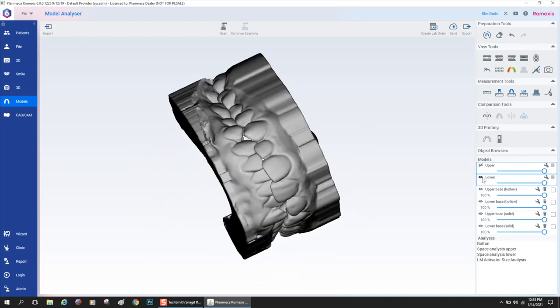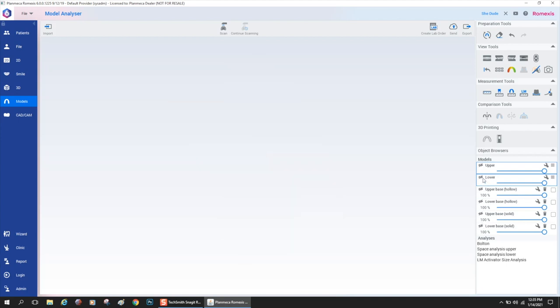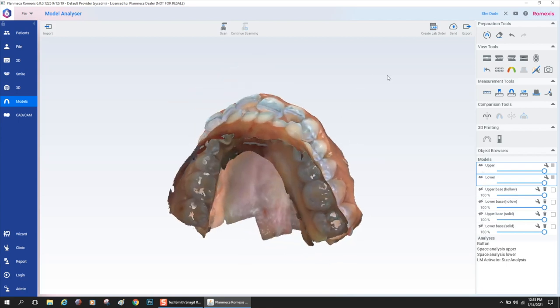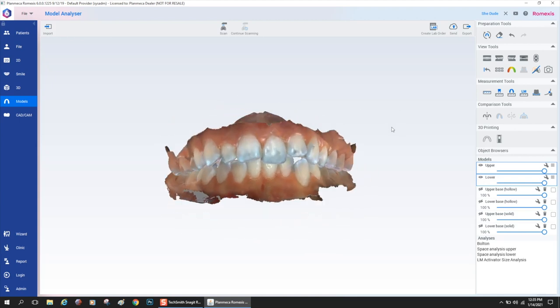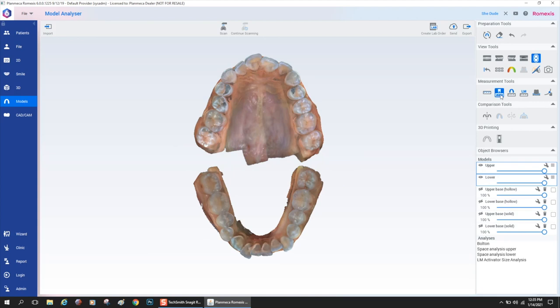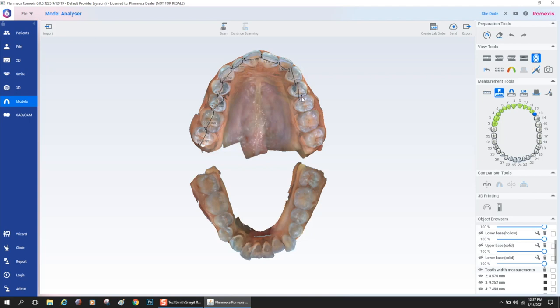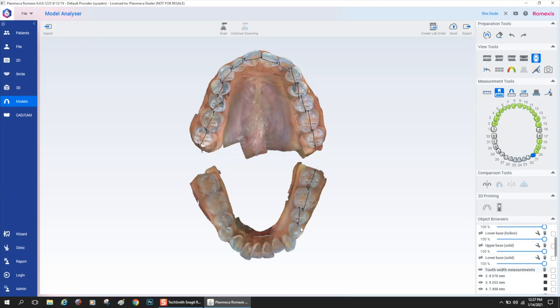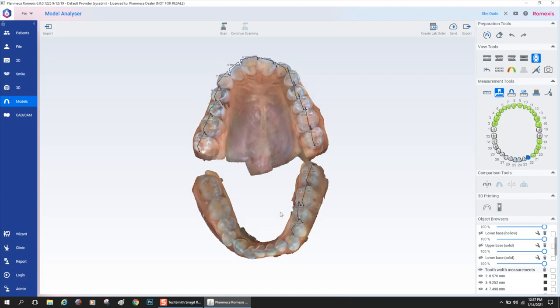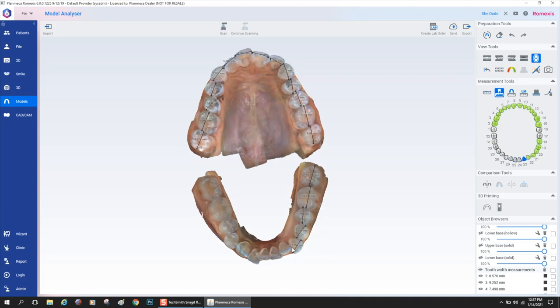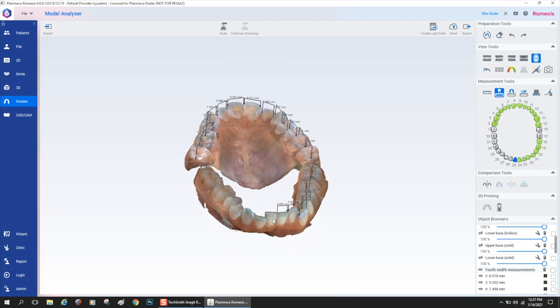What else can you do with this software? There's some ortho things that you could do. My Bolton analysis tooth size, arch size analysis. I'm going to open up the bite into this open tab, click tooth number two because they're missing. You can see that I'm just clicking each tooth, the true tooth mesial distal width, not looking at the tooth in the arch form, but just looking at the teeth individually, trying to find out their actual mesial distal width.